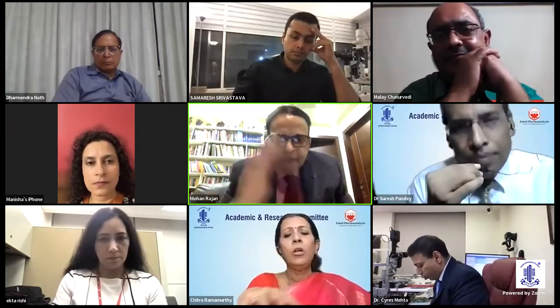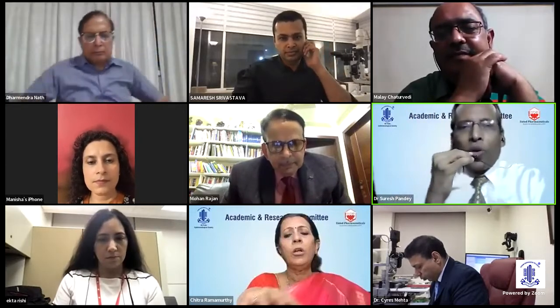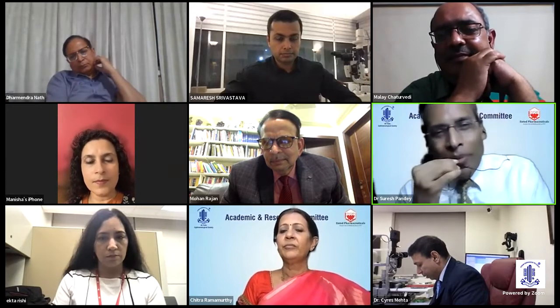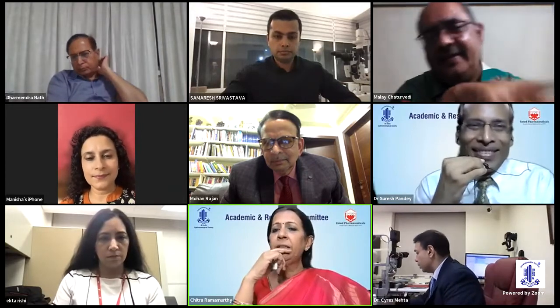Yes, Dr. Mohan Rajan, I think that's a very important point you have mentioned. This case we did in 2010, so at that time it was the first case, and we were trying to figure out the best way. I think your suggestion is wonderful. You can use the high-end microscope and the table to take advantage so that you can manage these cases nicely. Dr. Malay, you want to add something?